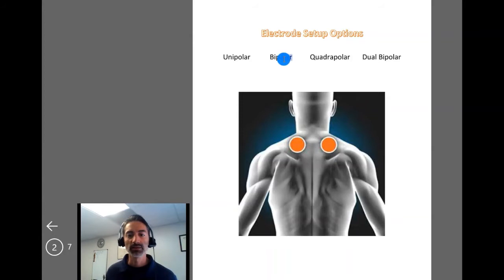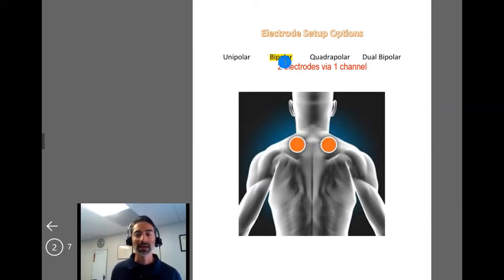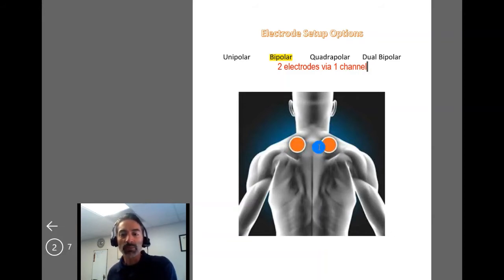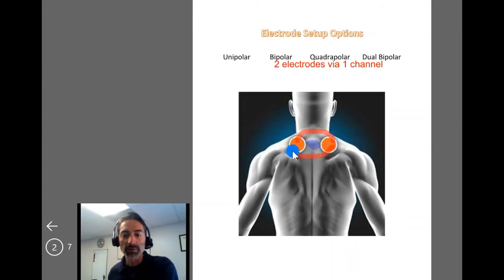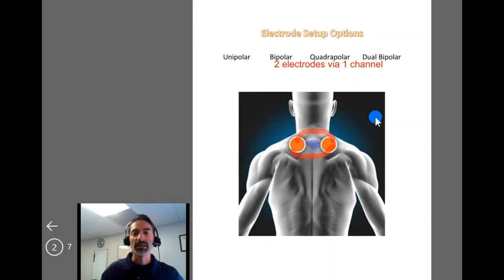A more common setup is bipolar. With bipolar, we're dealing with two electrodes via one channel. As an example, if an individual had pain over the cervical spine — approximately the C5 to C8 segmental range — you could use an alternating current with the electrodes to flip back and forth between the positive and negative electrodes, depending on the pulses per second.